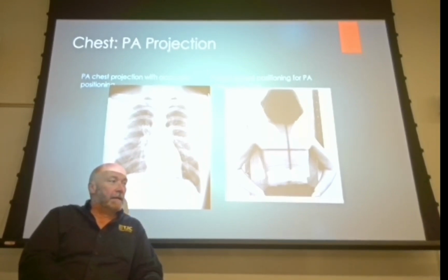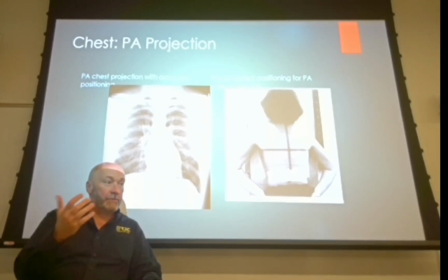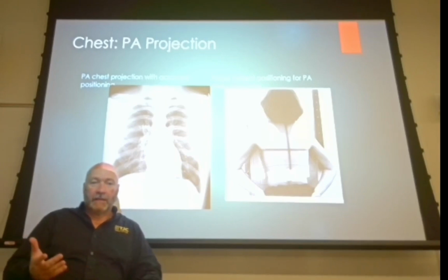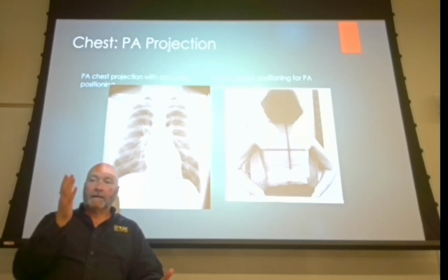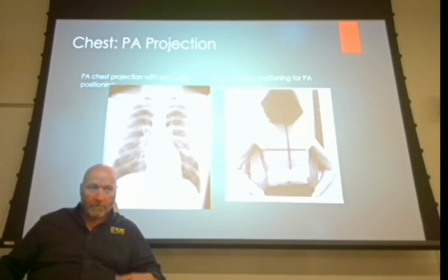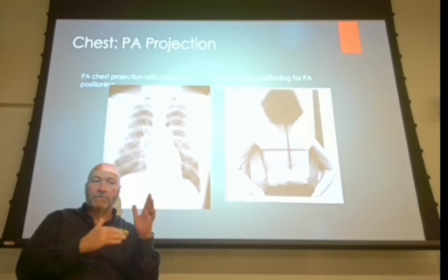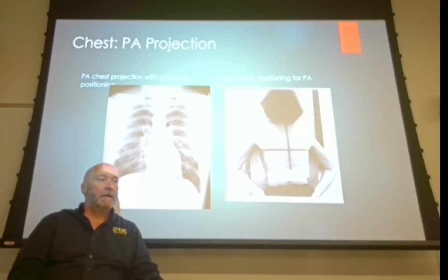They're doing their thing, and you're going to disturb all that, and you need them to sit up straight so that you can get a good chest x-ray. If you elevate the bed and the hips aren't all the way back in the bed, then you're going to get a slouched chest x-ray. The bed comes up, the chest bends forward, the hips aren't where they need to be, so it's going to further accentuate that slouch, and as a result the anterior chest field is going to compress. You're just not going to get a good chest x-ray.